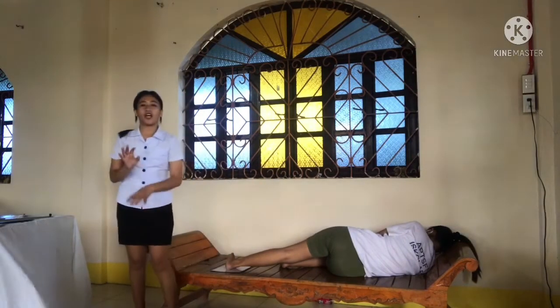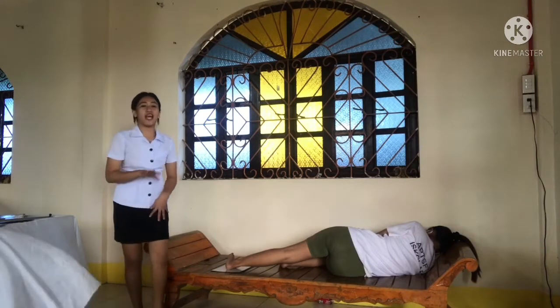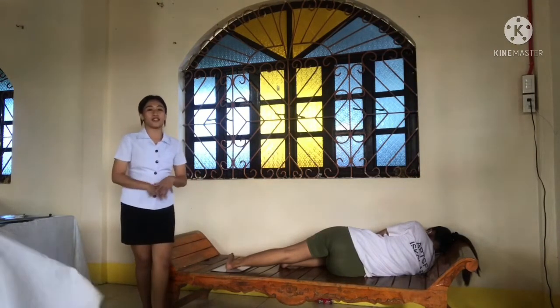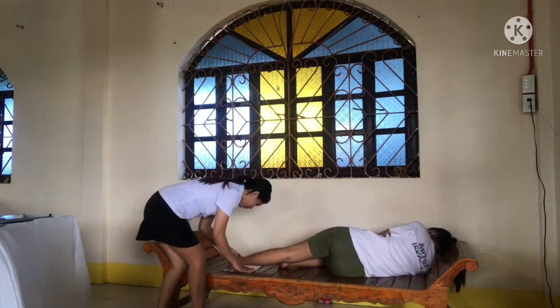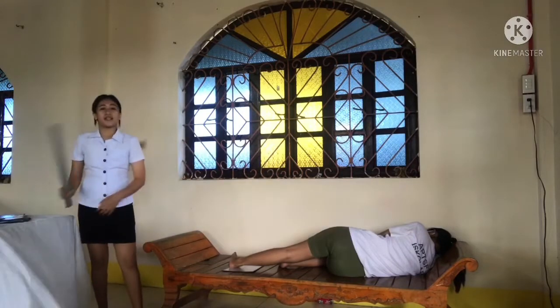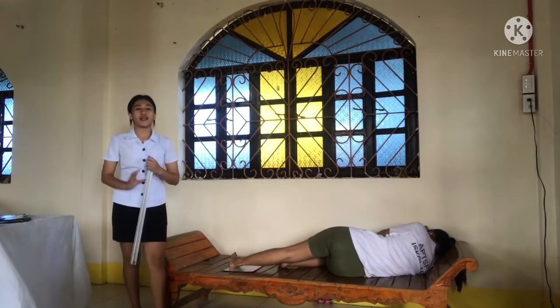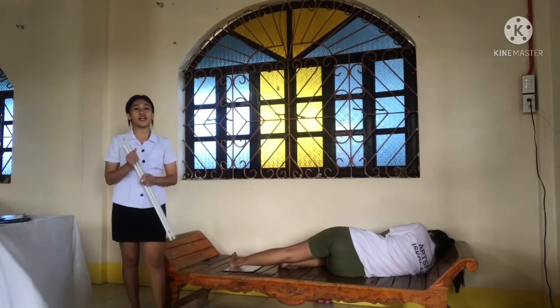So place the IR into the ankle joint and center it. Adjust the IR so that its long axis is parallel with the long axis of the leg. So the central ray for this projection is perpendicular through the ankle joint, entering 1/2 inch superior to the lateral malleolus.